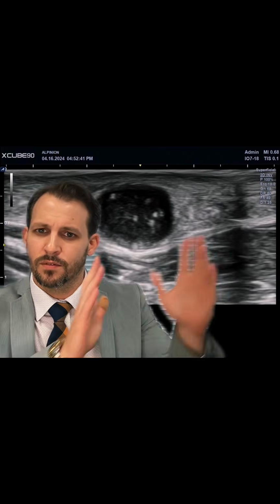I posted it on LinkedIn, and thank you to everyone, because social media can sometimes definitely work in the medical community. A lot of comments, including a couple of people that said this looks like a filariasis worm, which causes elephantiasis, very common in undeveloped countries, almost no cases reported in the United States, but it looked just typical to that. I did a little research.